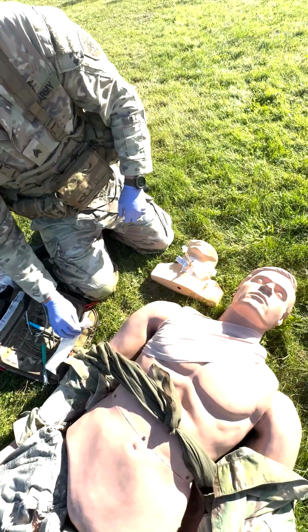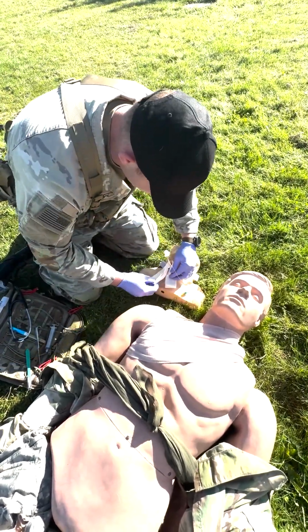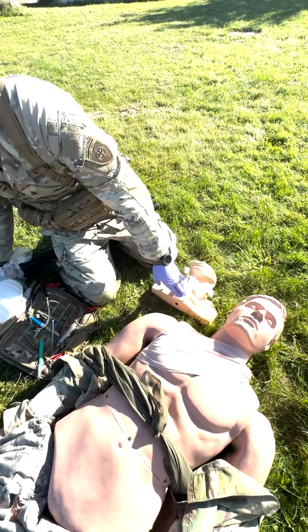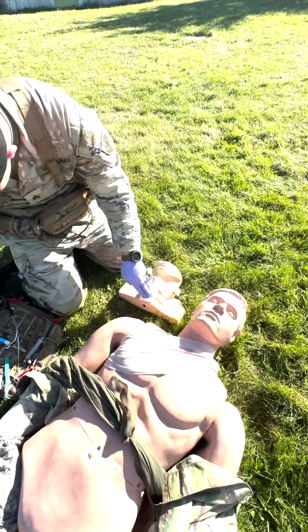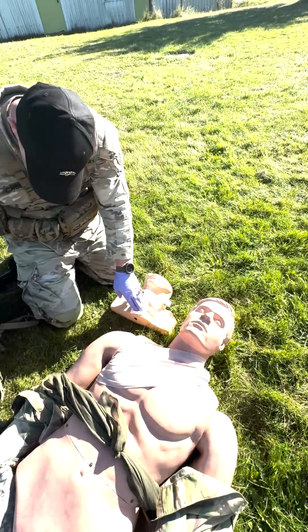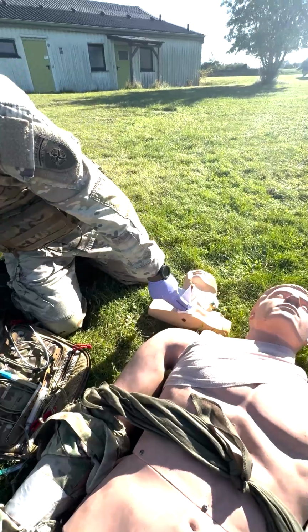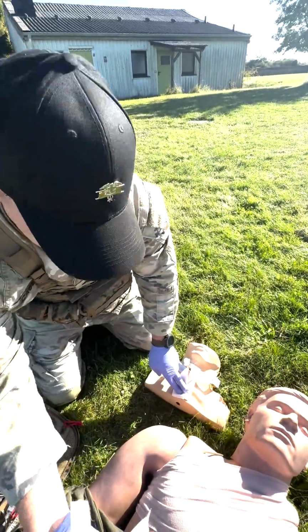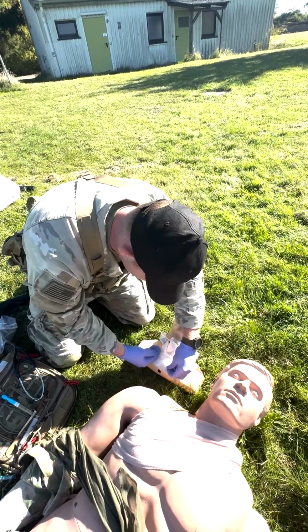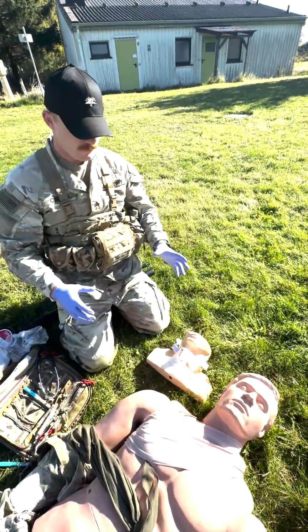Secured. I'm going to go ahead, take my gauze, wrap it around the tube. I'll then secure my gauze with tape. Where I put my tape, going from skin, gauze, skin. Alright, my cric is confirmed. I'm going to go ahead to my next casualty.